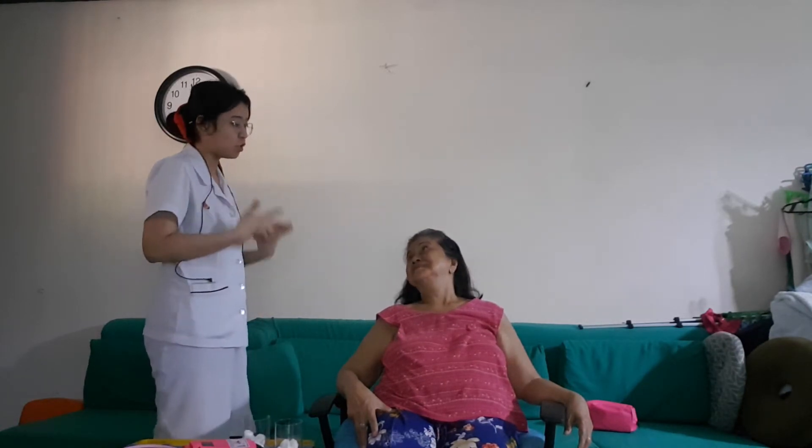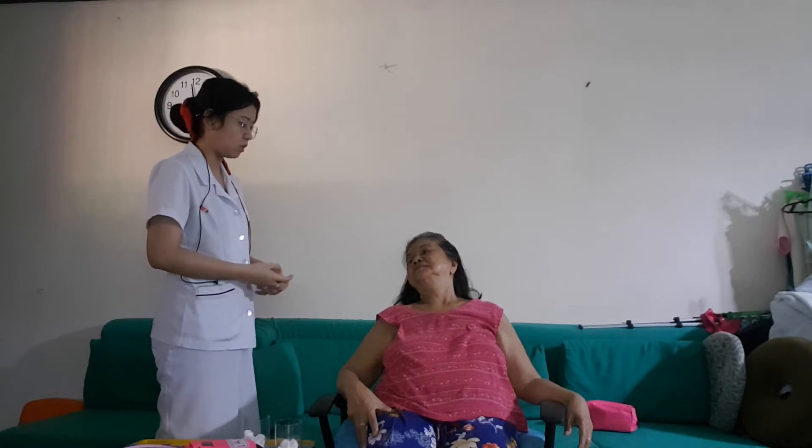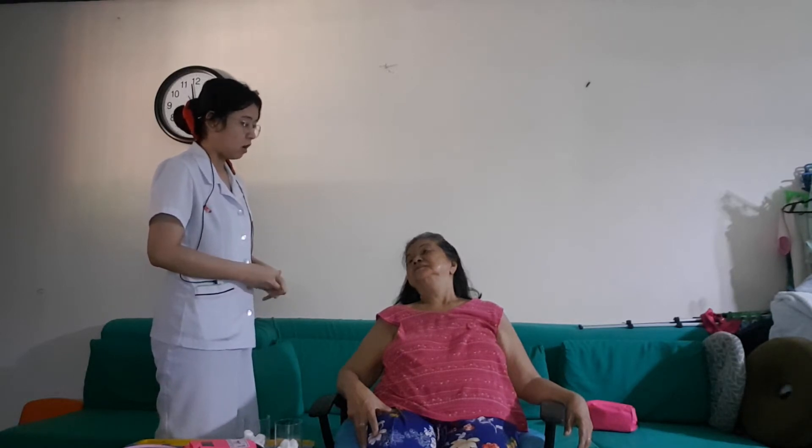Hi ma'am, I am Maricel Santos. I am your student nurse for today and I am here to do the assessment for your blood pressure. I just need to check if there's any problem so that we can prevent it as much as possible. I'll have to ask a few questions and you just need to answer honestly. Is that okay, ma'am? Yes. Thank you very much.